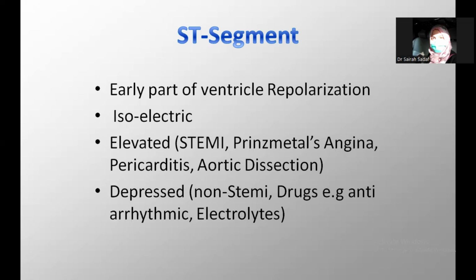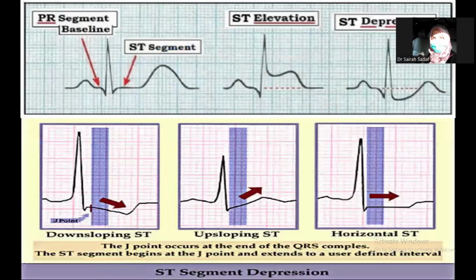When it is depressed, nowadays everyone is depressed. So ST segment may be depressed when there is non-STEMI, maybe due to different drugs, antiarrhythmics, and maybe due to electrolyte imbalances. Now, this is a normal shape of ST segment.